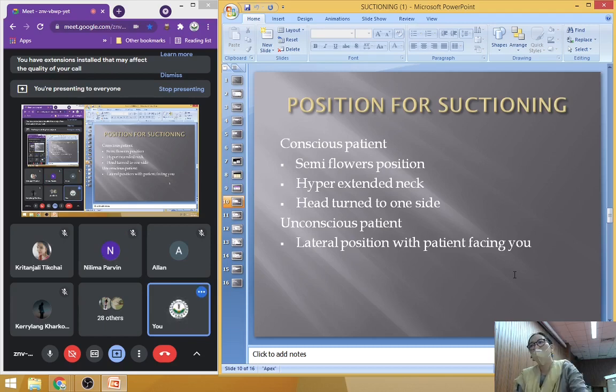You can bring a bowl of water. Yes, water. If the water is sucked, that means it is working, it is sucking, because it has to suck, okay? And anyway, we need to flush it also. So at the same time, we are flushing the catheter as well as checking whether it can suck or not. Then only we can start the procedure.